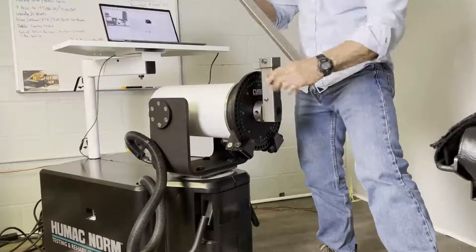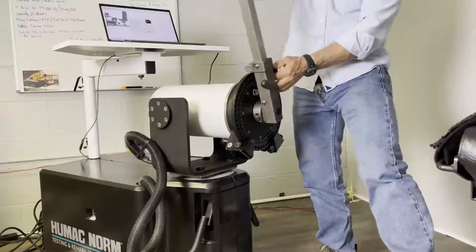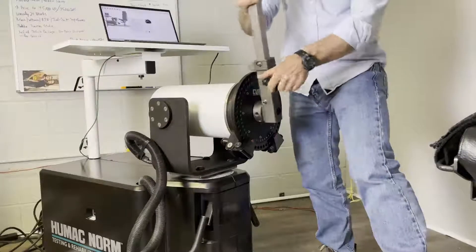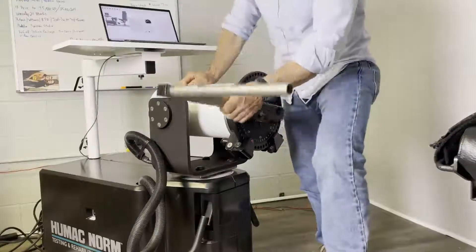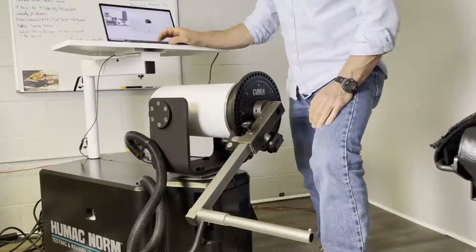If I loosen the knob, I slip this in, pull back, and let it click in — that's my 45. I tighten the knob. Then it says rest the input adapter against the teal U stop, which is right there. Now I click the checkbox.